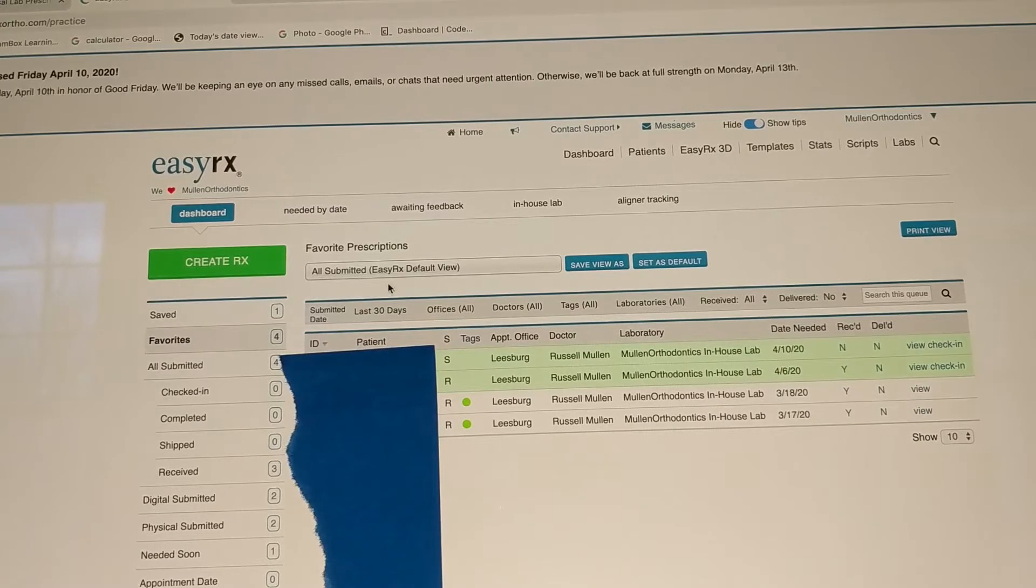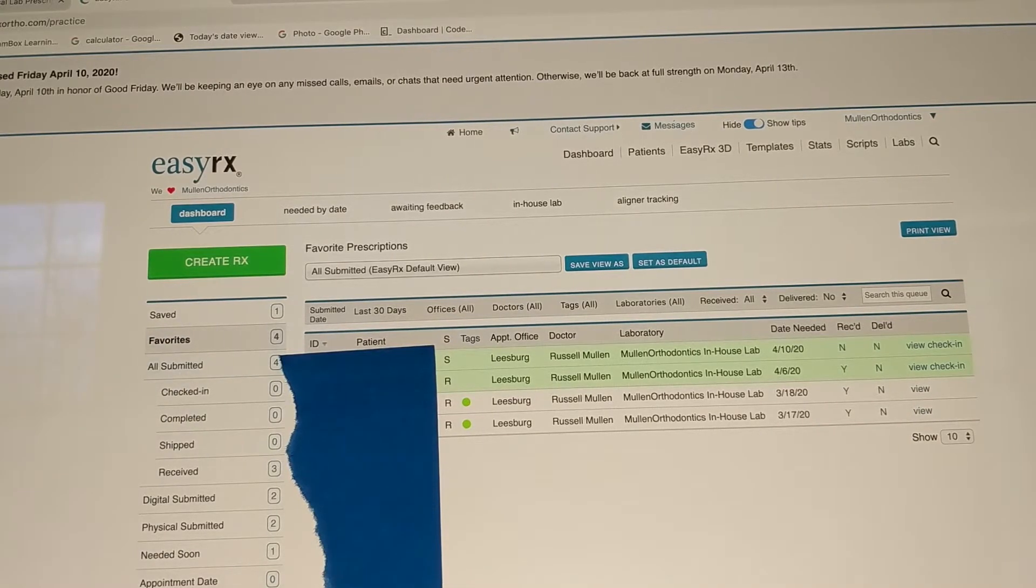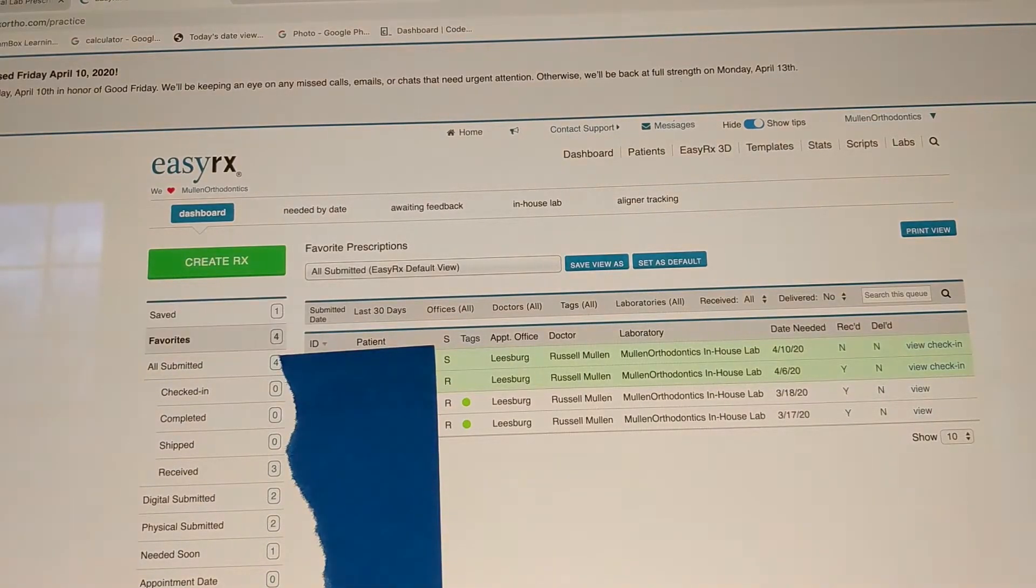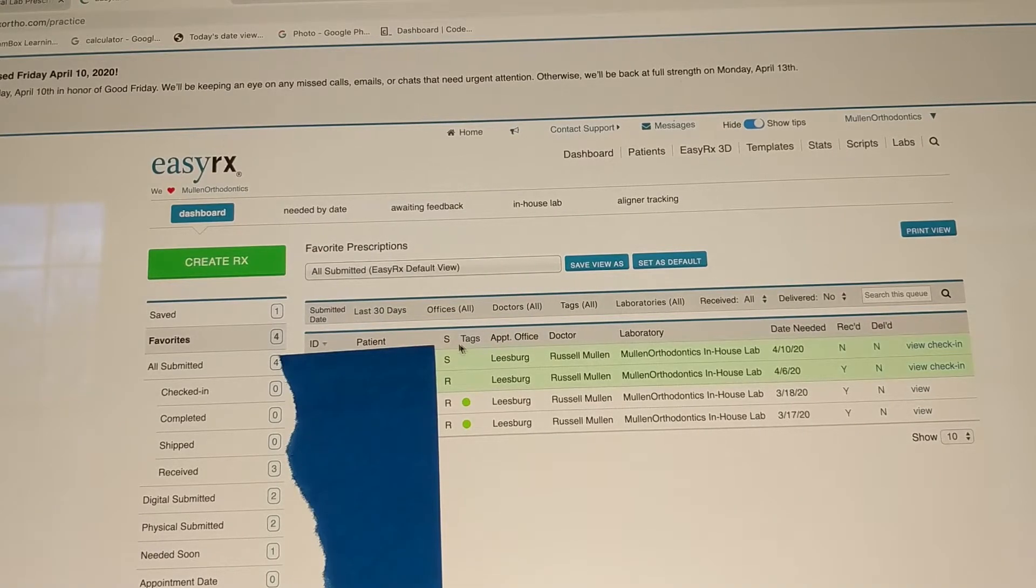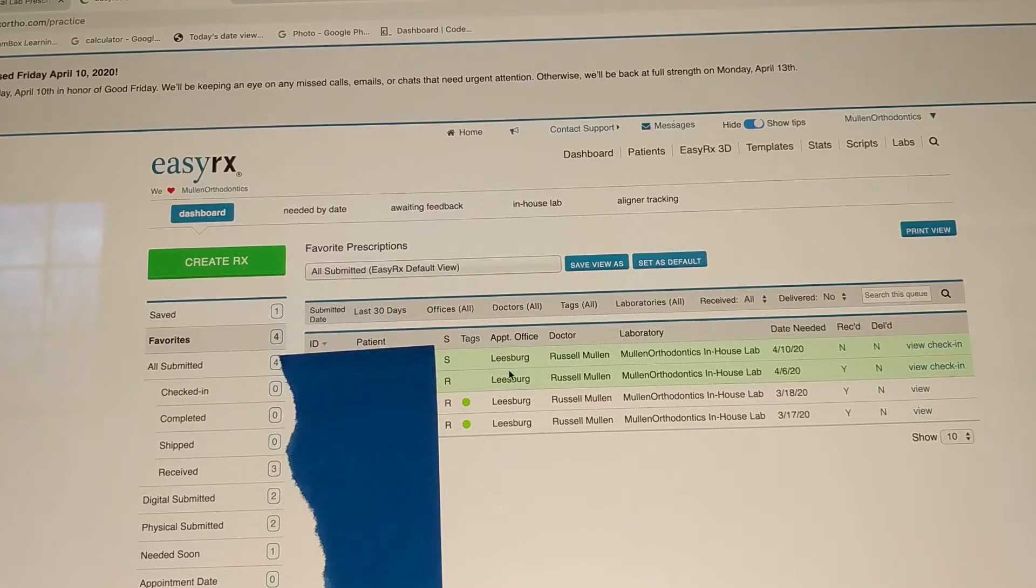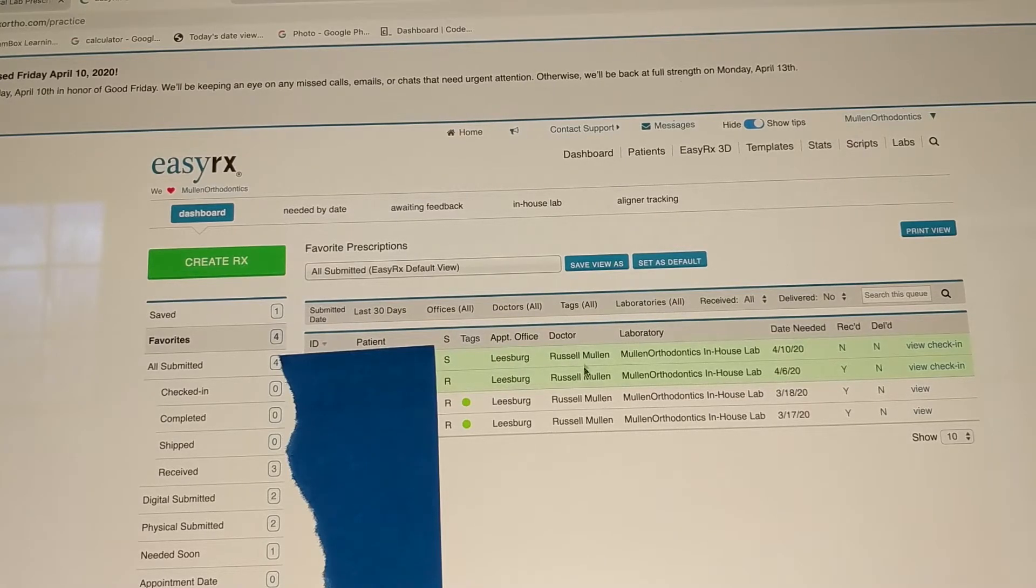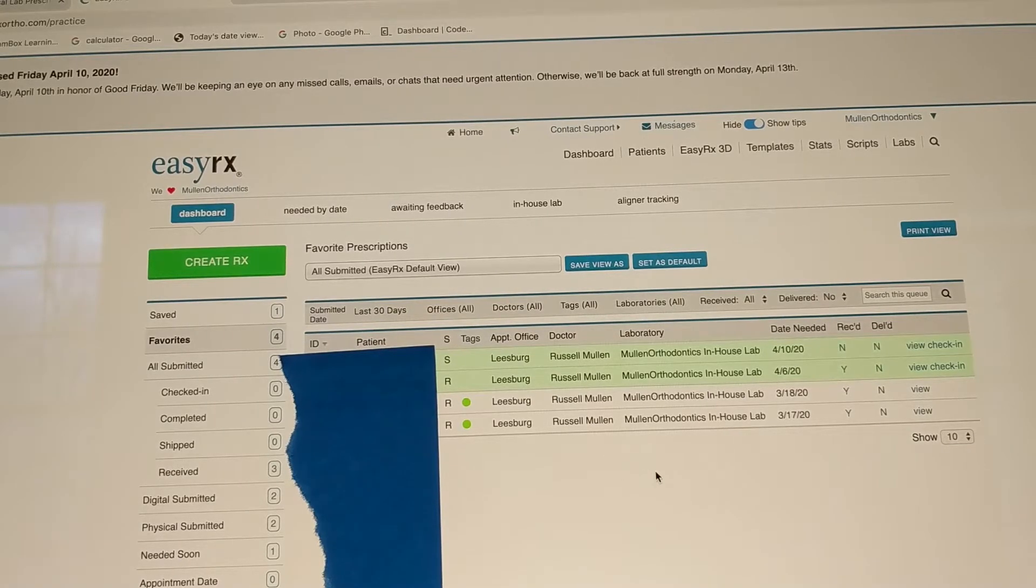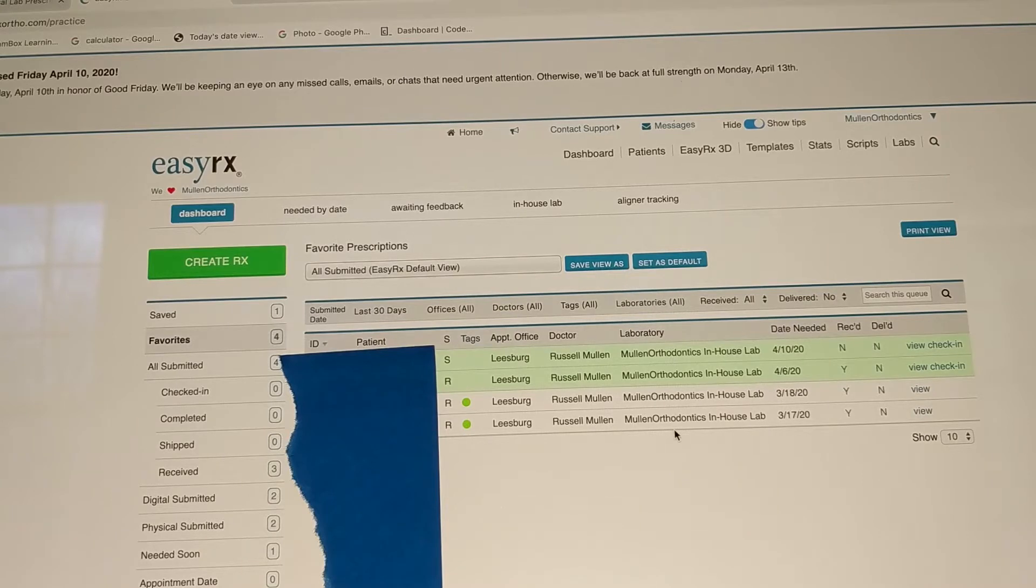So it shows you everything over here. You know, a bunch of tags that you can put on to easily find things needed soon, appointment date, etc. Here we've got the patient, special tags we use for special appliances, then a list of which office you want it at. You can choose a different office that you want it at. The doctor, so if you have several doctors in your office, you can designate which appliances for which doctor. And then also which lab it's being sent to.